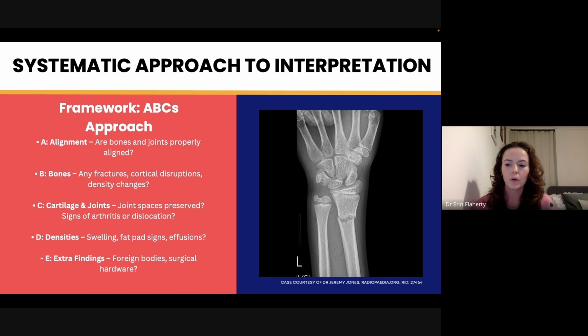And one of the most important things that a lot of people forget is looking at the date of the x-ray. It's really surprising how easy it can be to look at an x-ray that's from about 10 days ago when someone's come in today with a brand new problem. So definitely keep an eye on that. And as we said at the start, as with all x-rays, if you're handed an x-ray of a limb, always ask for a second one. In an OSCE, they probably won't give you another one, but to be able to fully assess a joint or a fracture or a dislocation, you always want to have 2, because these are just 2D images, and we want to try and see in as 3D as possible.